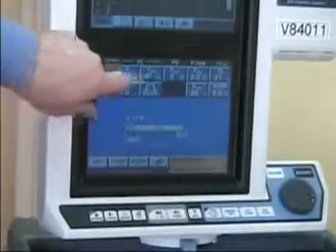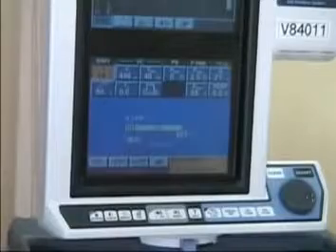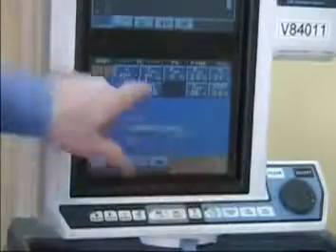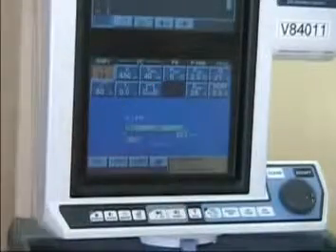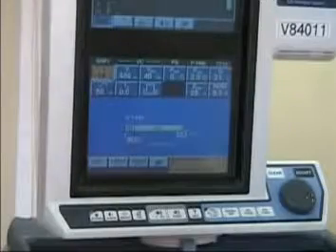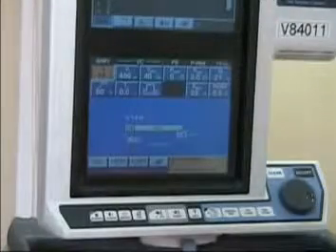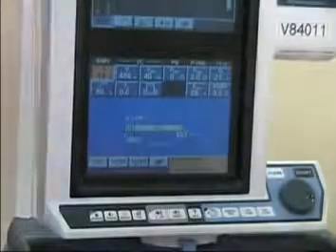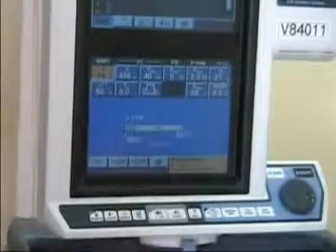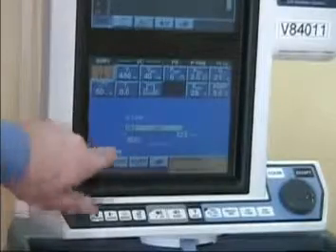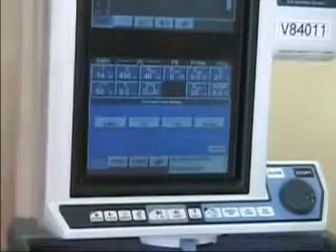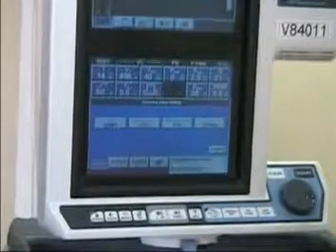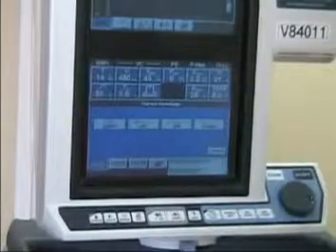If you want to change any of the parameters, you simply touch on it, change it with the rotation knob, hit accept. From this point on, the patient should be doing well enough to continue ventilation without your presence. That's why you have the alarm limits to watch over the patient while you're not available.